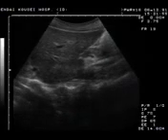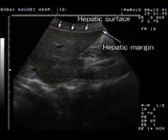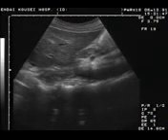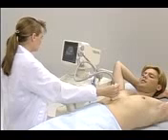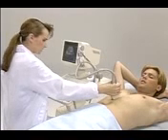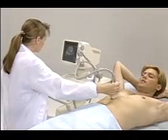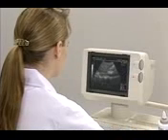On this plane, the left hepatic lobe is visualized. Check if the hepatic surface is flat, the hepatic margins form acute angles, the size of the left lobe is normal, and the hepatic parenchyma returns fine-textured, uniform echoes. When you want to obtain a clearer image, have the patient do abdominal breathing and have him breathe in and then hold his breath.